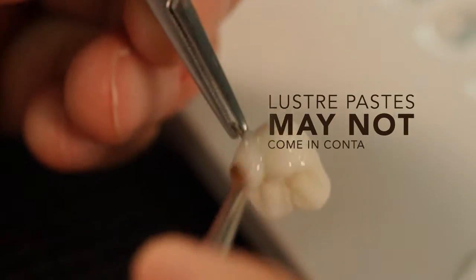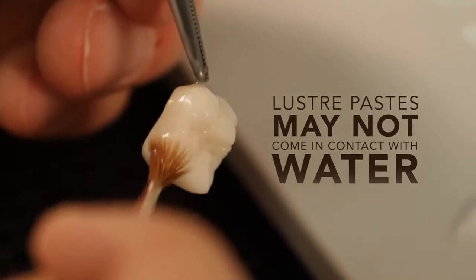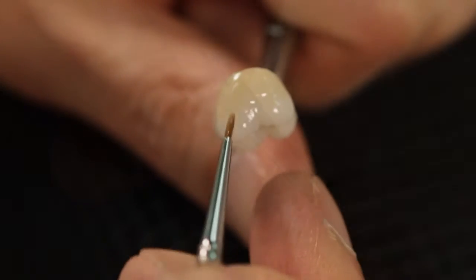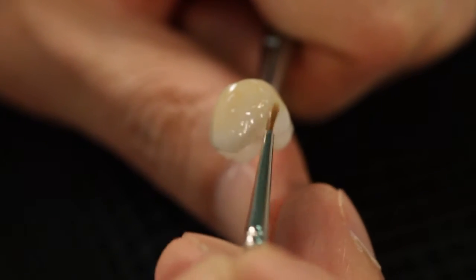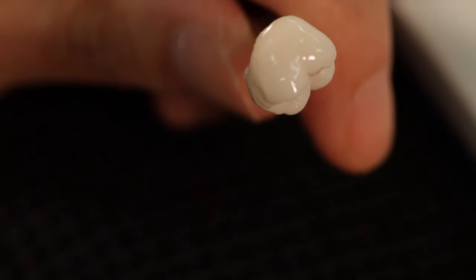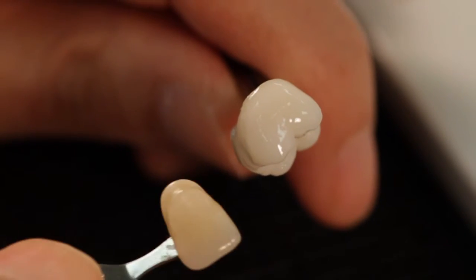Note: these Lustre Paste may not come in contact with water. The requested Vita Pan Classic shade is created by a more or less intensive application of the Lustre Paste body A through D. This process, which only takes two minutes, is everything which is necessary to create Vita Pan Classic shades.